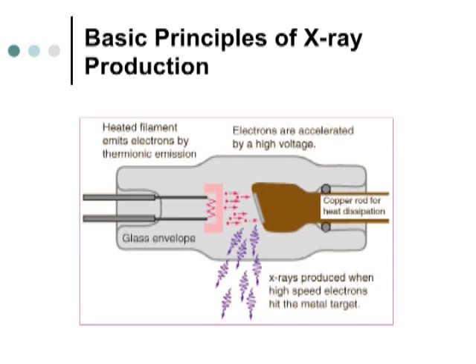And resistance. So this is a typical X-ray machine. We call it a diode tube because it has a cathode and an anode. It's also a vacuum tube. We suck all the air out of it to improve the efficiency of the X-ray production. Because we're accelerating electrons, we don't want them to interact with anything except the target.